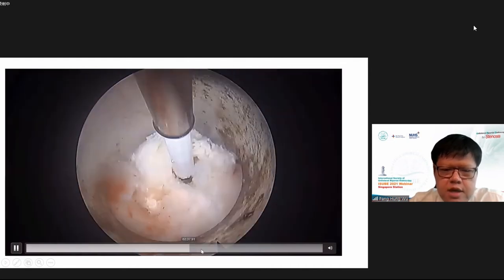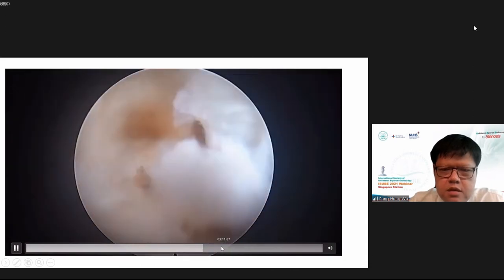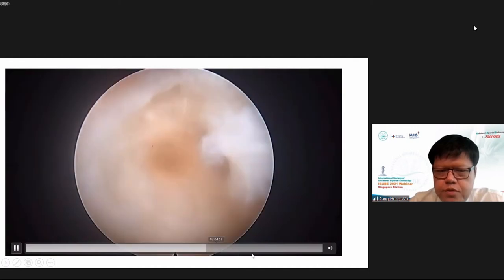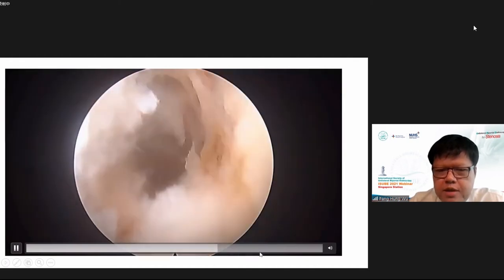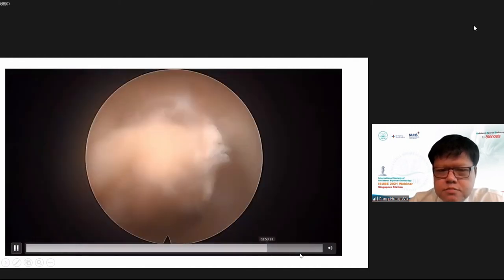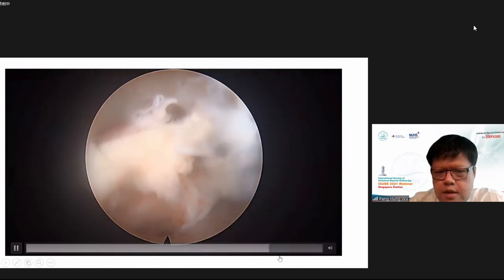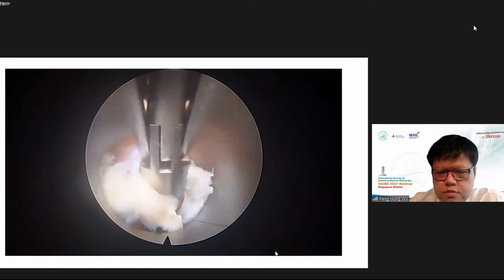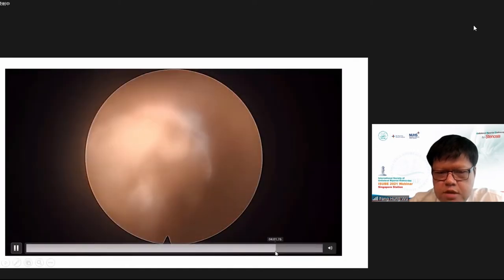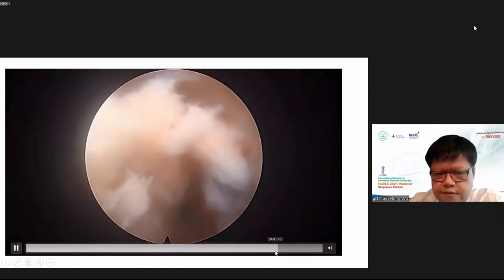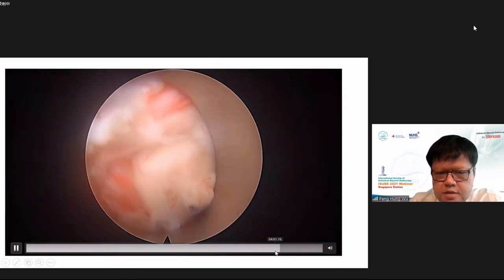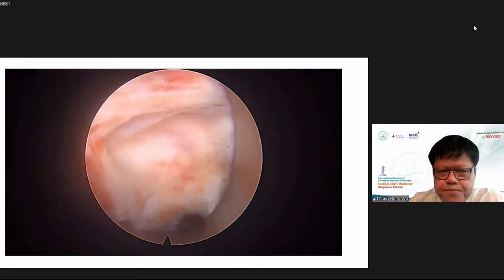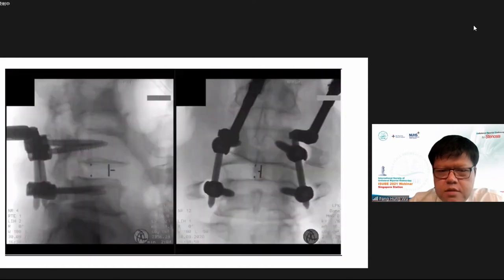We rotate the tube to perform the discectomy, then isolate and coagulate. This part is similar to biportal fusion. We prepare the end plate, and eventually put in the cage, which is inserted under fluoroscopic and endoscopic guidance. The nerve is decompressed.